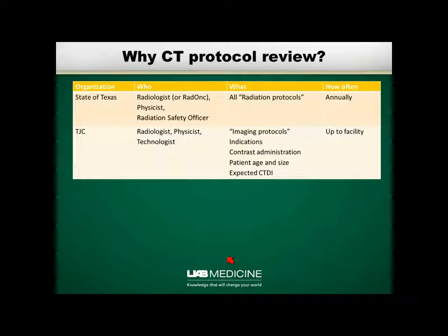They require that you review all the imaging protocols, and they want fairly detailed reviews. Indications: what kind of patient problems are going to cause this particular exam protocol to be used? What's your protocol for injected contrast administration? Is this protocol for adults, children, infants? What's the expected CTDI and so forth?